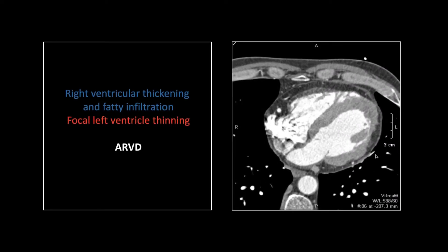Let's go through some myocardial and pericardial abnormalities. This is a nice one — you can see very nicely on CT here fatty infiltration and thickening of that free right ventricular wall. Just a classic finding for arrhythmogenic right ventricular dysplasia. What I find very interesting about this study is the left ventricle, which is clearly dysplastic as well, with that focal irregular thinning of the myocardium.